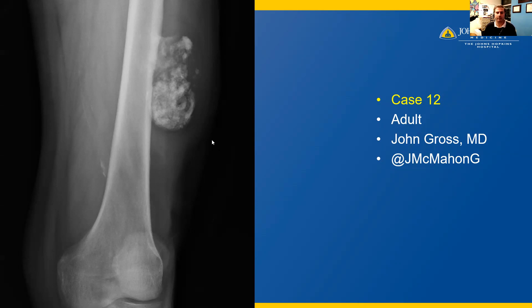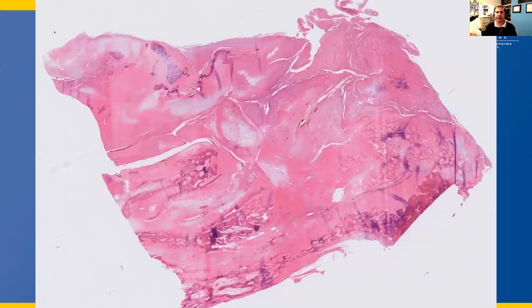The specimen was resected and here we have a very low power photomicrograph showing a chondroosseous proliferation with various areas of well-formed bones, as well as other areas of nodules of hyaline cartilage and lots of fibroblastic areas seen as pink, variably cellular regions from this low power view.